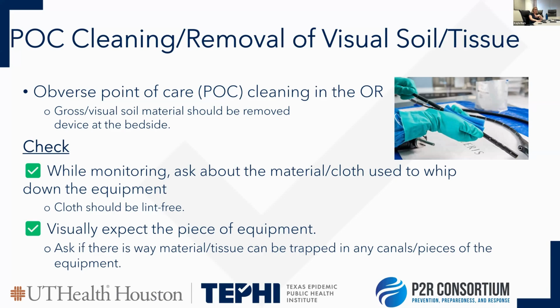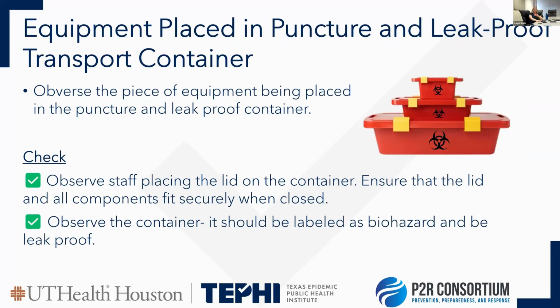If there are any channels or canals within that piece of device, ask if there's anything stuck in there. Another good thing to check is that all pieces of tissue have been properly taken, labeled, and sent down to pathology, and not accidentally put in the decontam or thrown away. That's another thing to be mindful of there.